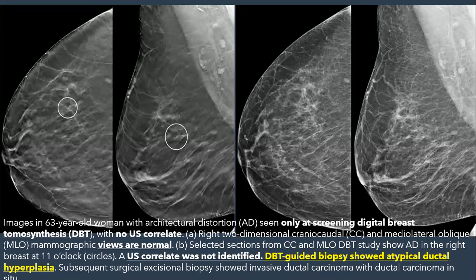That is why nowadays for screening they combine the 3D along with the 2D. And because of the radiation, they started to discuss synthetic 2D mammography. From the 3D, they create the 2D by post-processing, instead of exposing the patient twice, for 2D and 3D. But at the same time, they are studying the advantages and disadvantages of this in screening mammography.